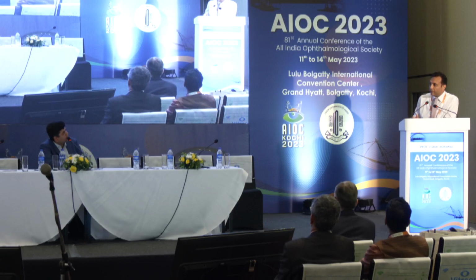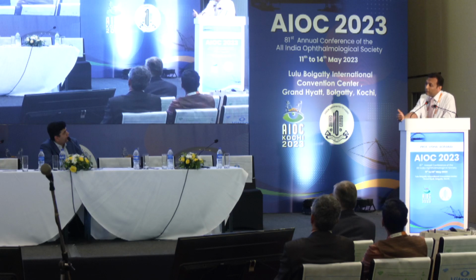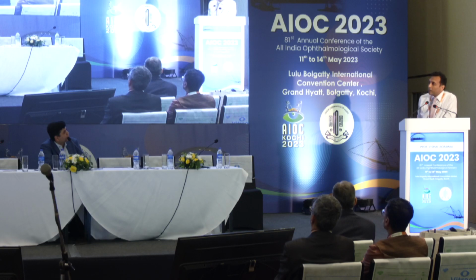There's no point in touching these patients if they have ambulatory vision and a good navigational vision. If the only indication for surgery is a progression and a deterioration with serial OCT follow-ups, you might see significant fluid and significant traction in the OCT, but the patient still might be comfortable. If the patient tells you, like Dr. Lalit said, that the vision has gone down and he or she is not able to do daily activities now, then you touch these eyes.